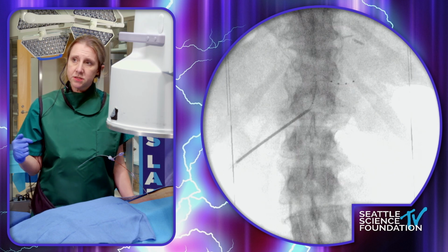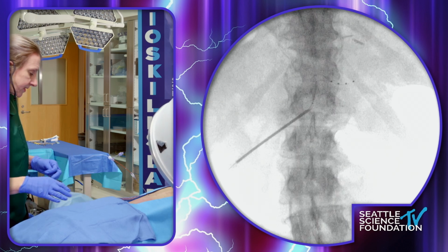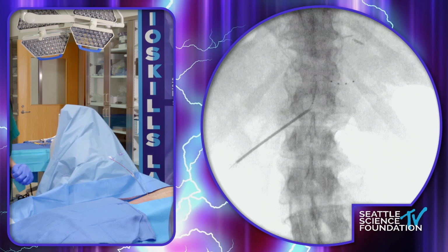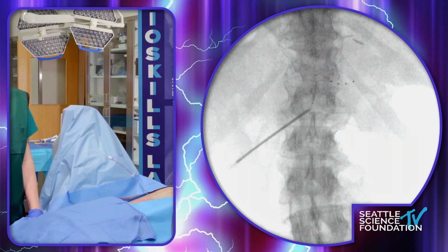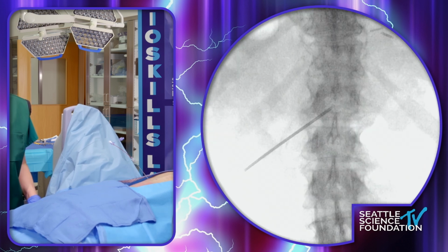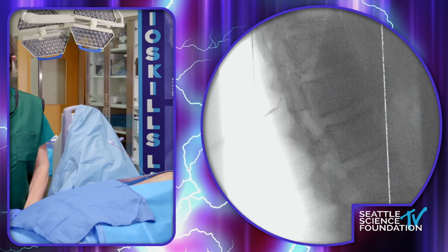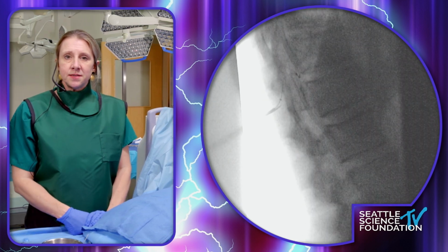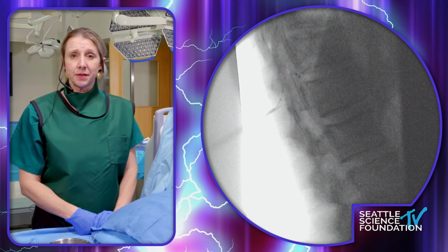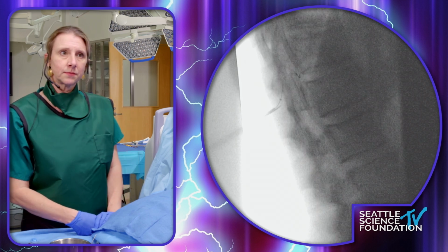Could I please see a lateral image? So on our lateral view, what we'll be able to see is that this lead is situated, no problem, in the dorsal one half of the neural foramen, which it is. So this would be a setting for the DRG trial lead that I would be really pleased with and have confidence that my representative is going to have ability to stimulate this L1 nerve root. Contacts look like little circles sometimes here, directed toward you.